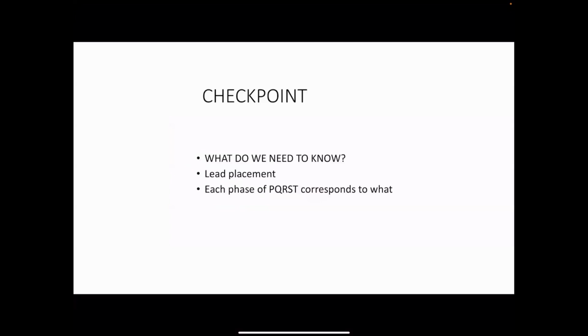That's it. So what do we need to know from all of this? You really need to know the leads placement and what each phase of the PQRST corresponds to.